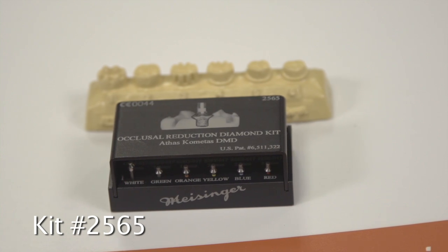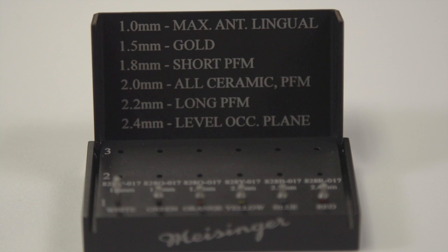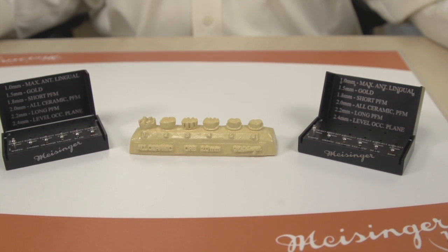This is Kit 2565, the Occlusal Reduction Diamond Kit by Athas Kometas, DMD. It's a series of occlusal depth-cutting burrs designed to allow for perfect reduction of the occlusal surface.